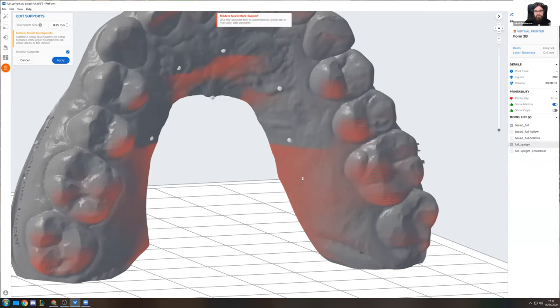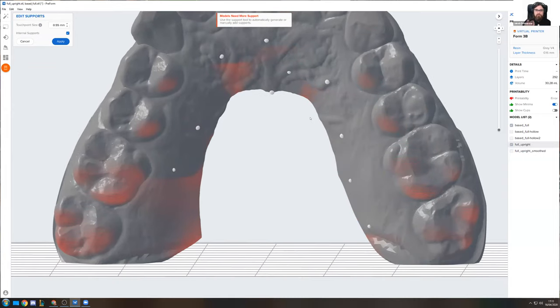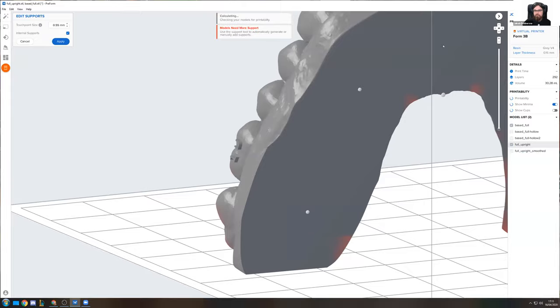So, and then you can see these red shadings right here. This is basically also just PreForm helping you out with this. And then you can just add a couple more supports in, and seeing how many supports you need to actually get rid of all of these red shaded areas is something that will come with experience. You can see that I actually do not have a lot of supports right now.